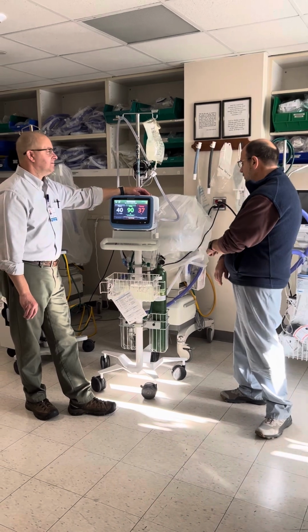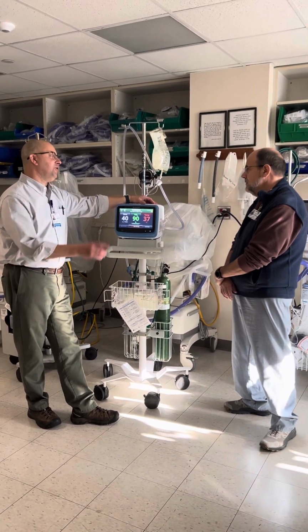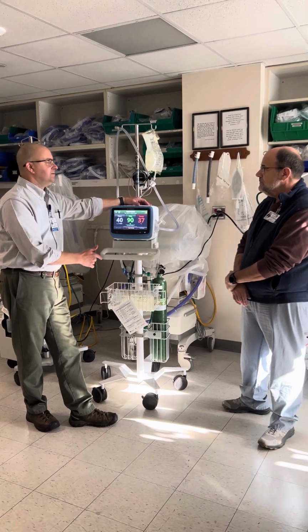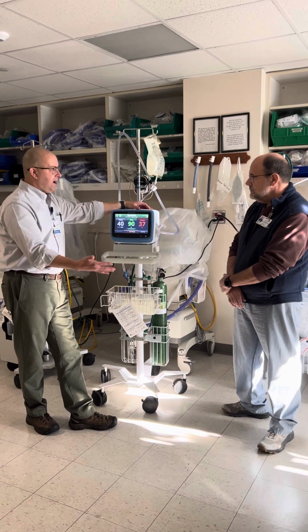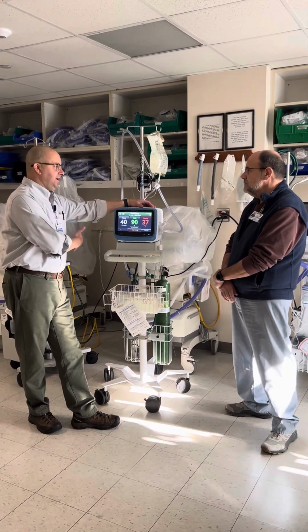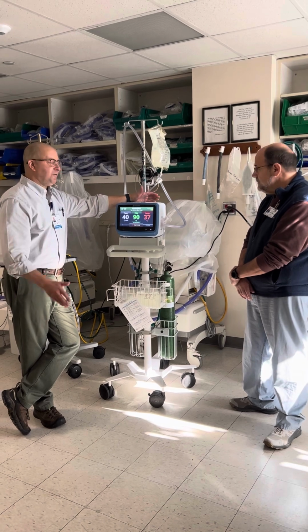An hour per tank at max flow, along with an hour-long battery. Absolutely. So if we were going to CAT scan, for example, you'd want respiratory to go with you, so we can make sure we're hooking back up to the wall oxygen and plugging the unit back in so that it continues to charge the battery. Excellent, great. Other than that, everything is the same.